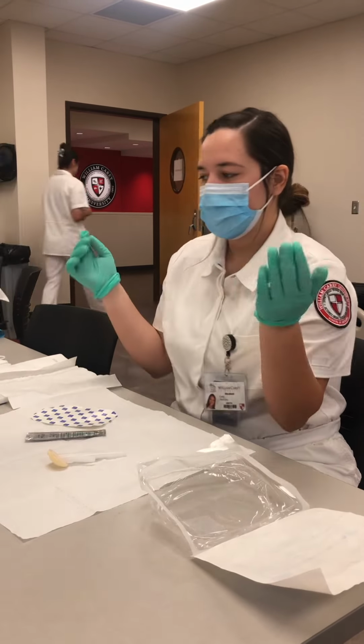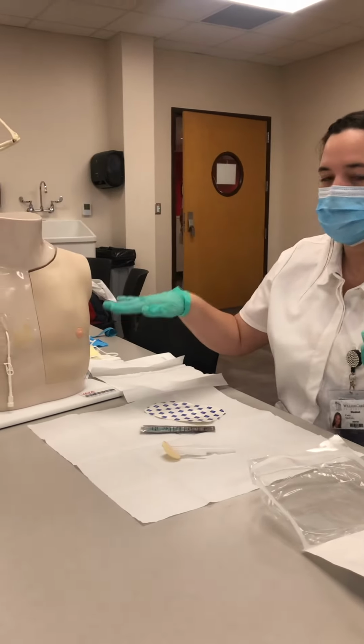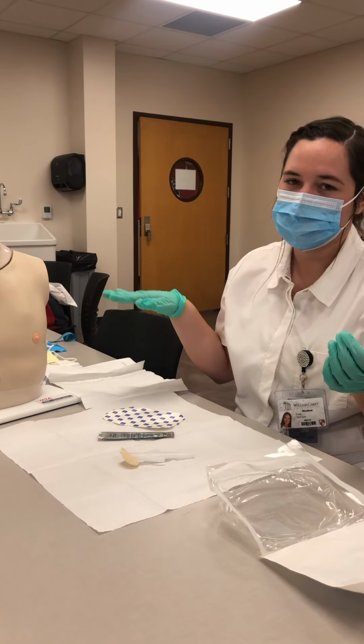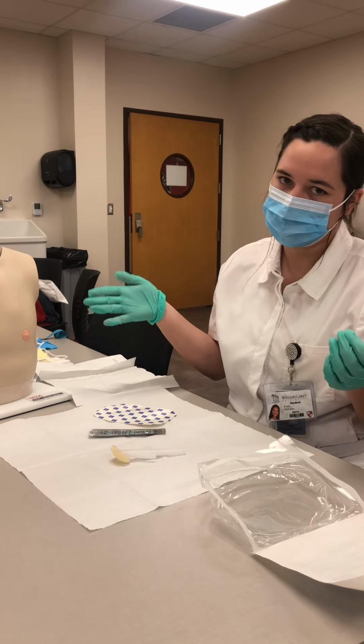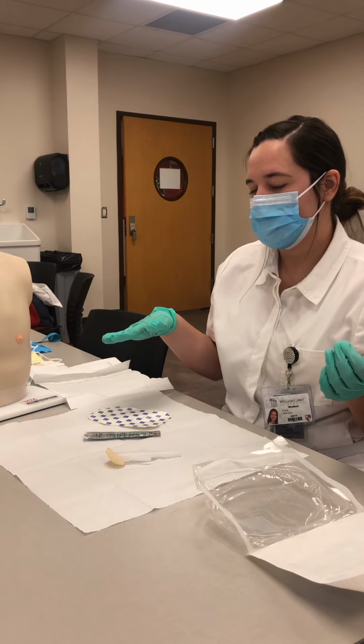Okay. At this point, we're going to assess the wound and the insertion site at the catheter. We're going to be looking for any type of redness, infection, swelling, any reason that the patient is not taking the catheter well. So he's not having any signs of that.